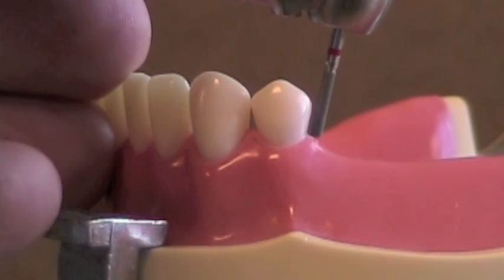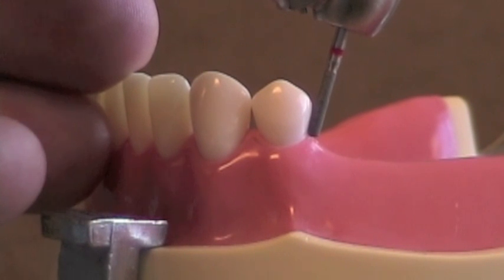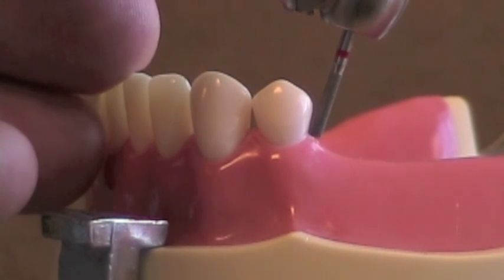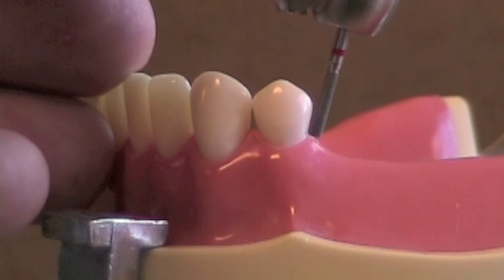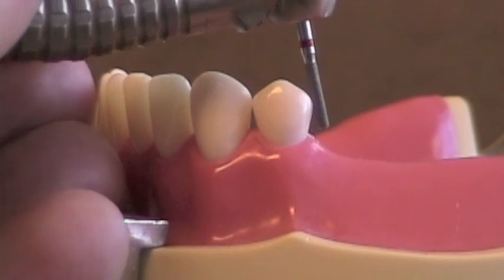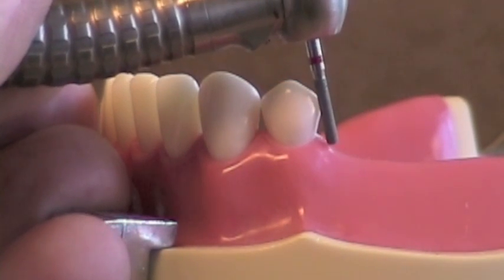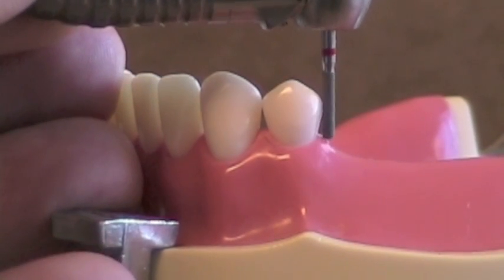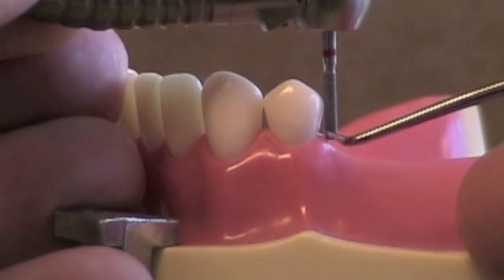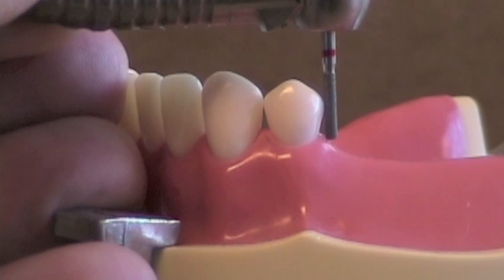Intraorally, we want to make sure that we've got our burr aligned exactly the same. Here you can see I've got it tilted much too far toward the distal as we move toward the occlusal, so I want to change my angulation of my burr. I don't want to go so far that I get a huge undercut below the height of contour. I want the amount of space between the tip of the burr at the free gingival margin and the tooth to be as similar as what I saw on my cast.